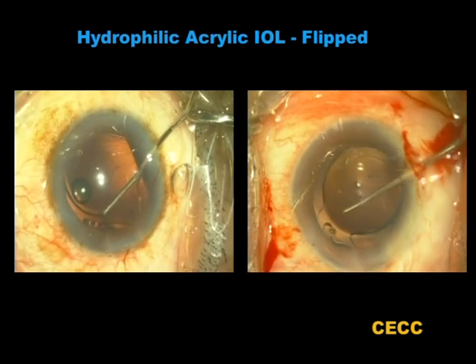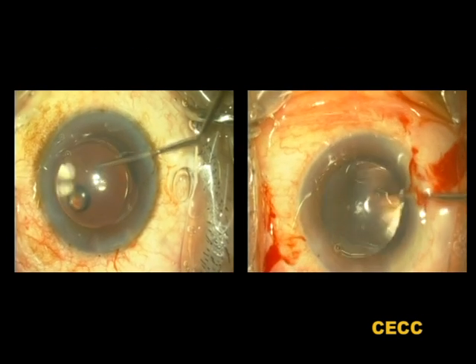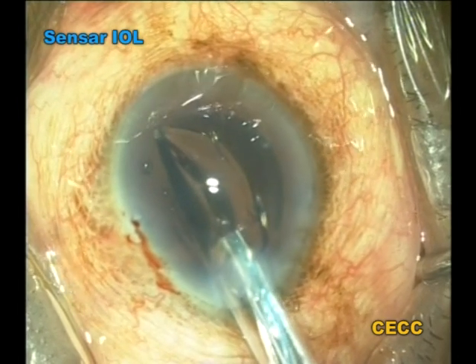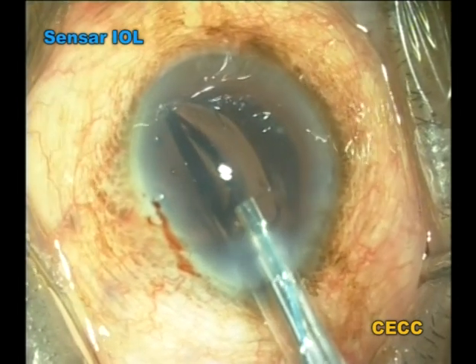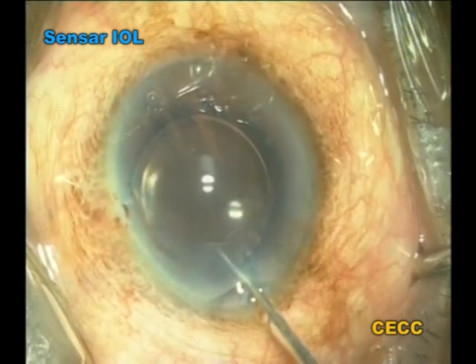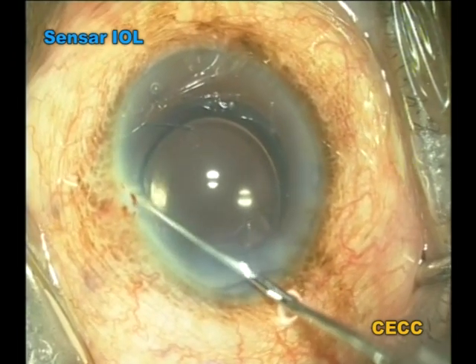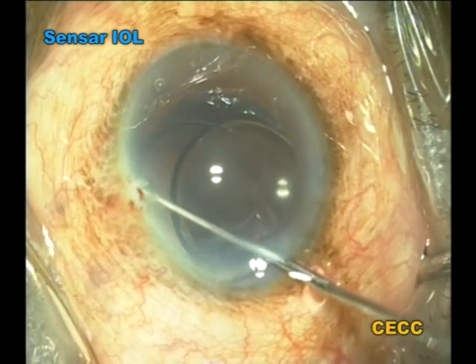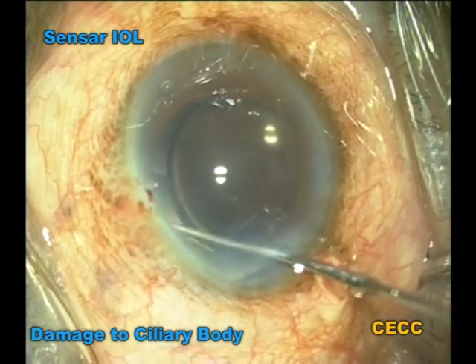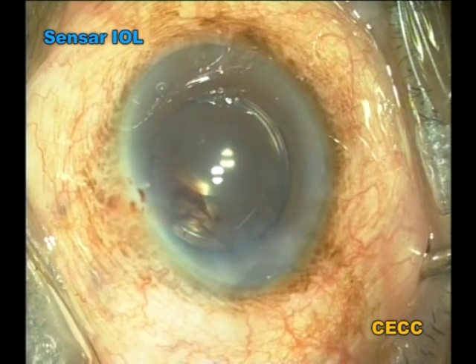The trailing haptics of both IOLs were subsequently tapped into the capsular bag. The trailing haptic of any lens may be inserted within the capsular bag or sulcus using the compression technique. Here we demonstrate the technique using the Sensar intraocular lens. This being a blind procedure may at times be hazardous and result in trauma to the ciliary body. Bleeding in this case was arrested by hyper-inflating the anterior chamber and raising the intraocular pressure.